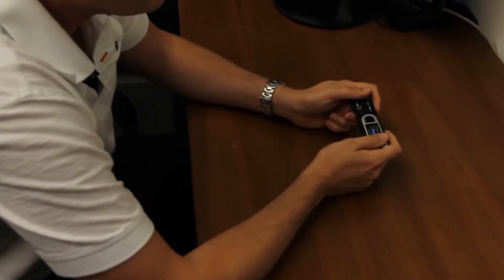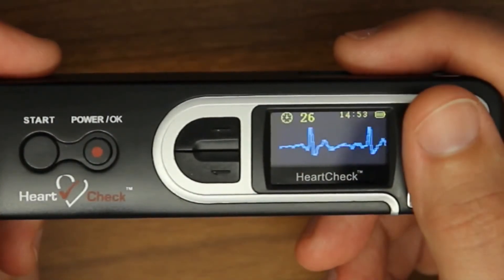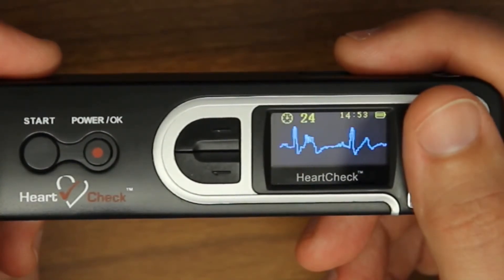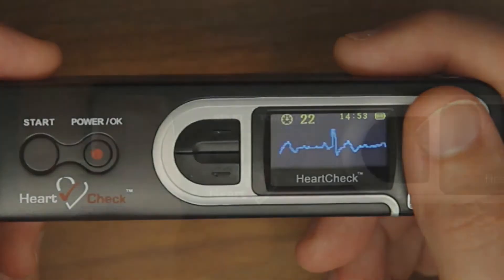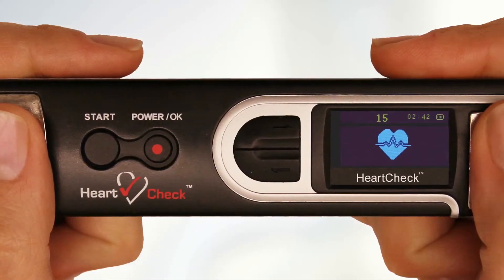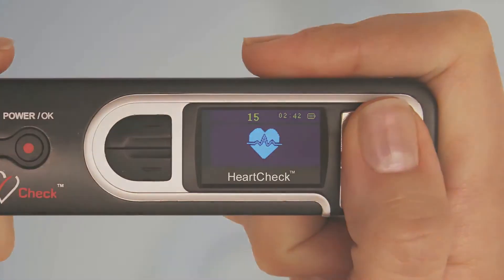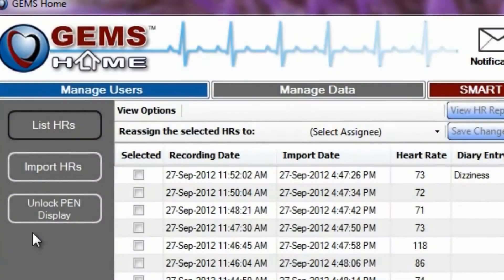It takes 30 seconds to obtain a complete measurement. In unlocked mode, the HeartCheck pen will display your ECG waveform during the reading period. However, if the pen has not been unlocked, during the reading period a heart icon will appear in place of your ECG. Later in the video we'll show you how to unlock your HeartCheck pen device using the free GEMS Home software.